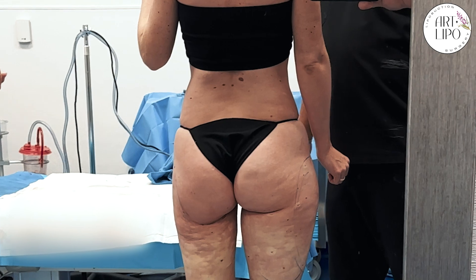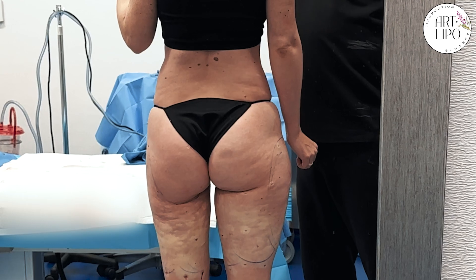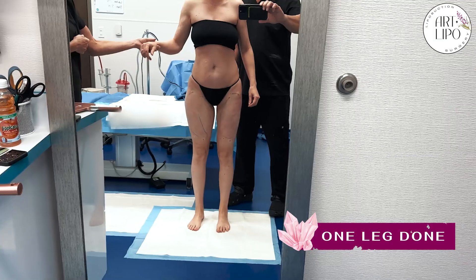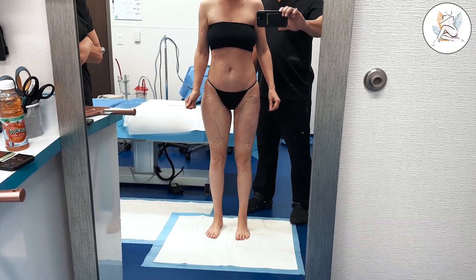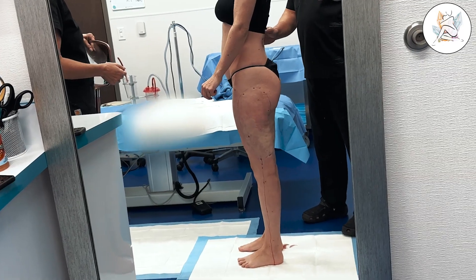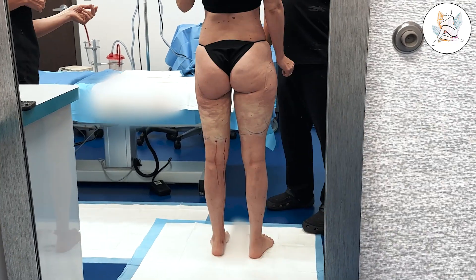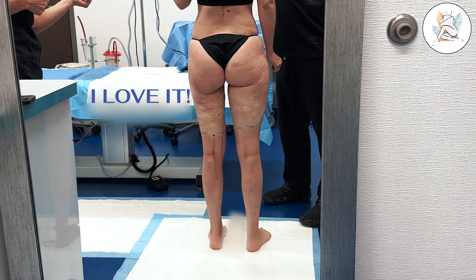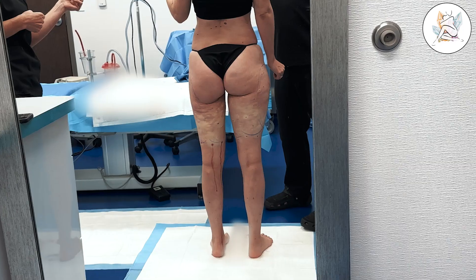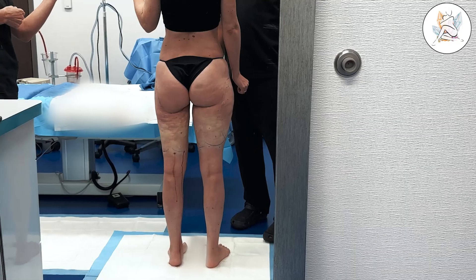How was it? Numbing was super painful, but once we got started on the lipo, it wasn't bad. Just do it fairly quickly so you don't hesitate too much. Oh my gosh — that is crazy. Wow. Quite a bit more projection. Oh my gosh, I love it. Most people see their butt cheek return to its normal position — all this fat here actually smashes up the butt cheek so it looks kind of straight.